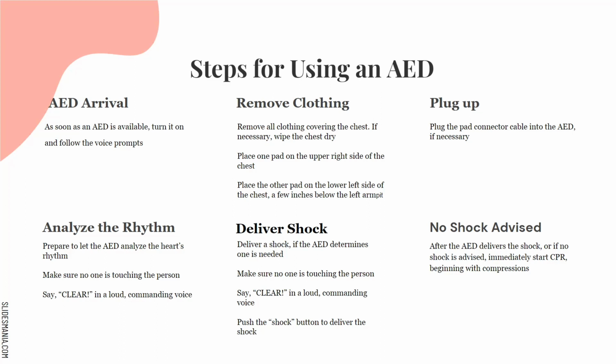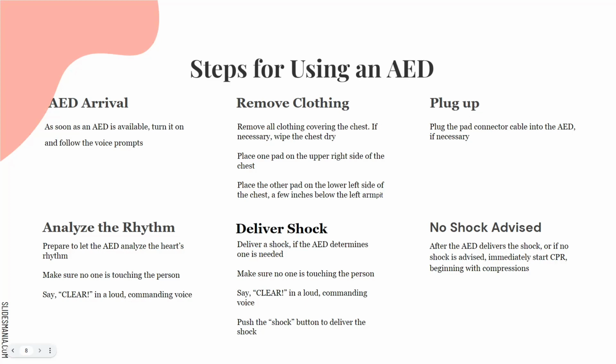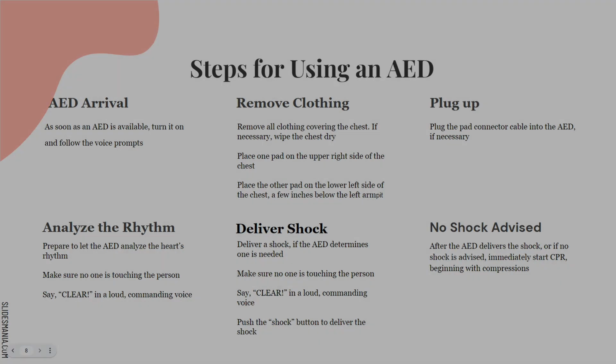The steps for using an AED. AED arrives, the sooner the better. The sooner it arrives, the greater the chances of that patient or that person living from that heart attack. You are your first responder. Take care of your family. Please take care of your family. Learn CPR, learn the uses of AED. Get out there and train. You are your own first responder. It is important that you actually understand the steps of AED as well as steps in the process of CPR. Because again, you are your first responder. It is up to you to take care of your family.